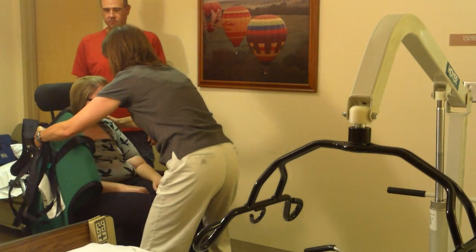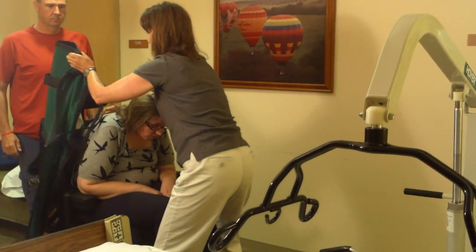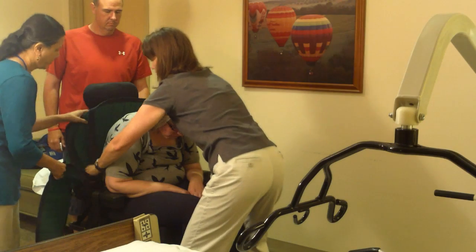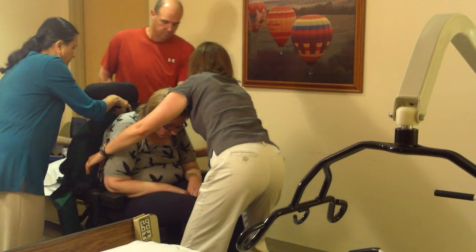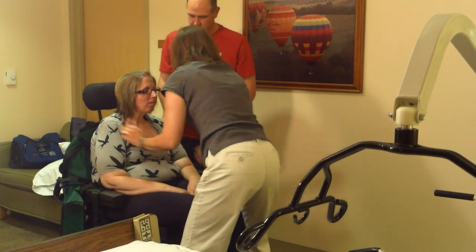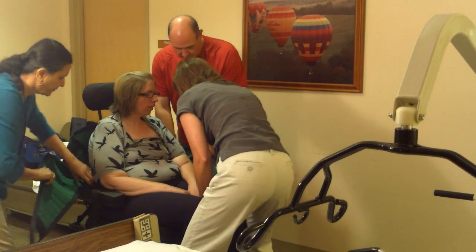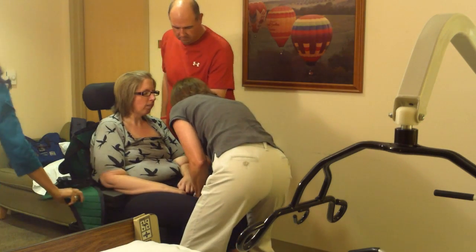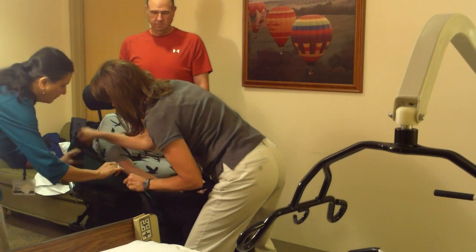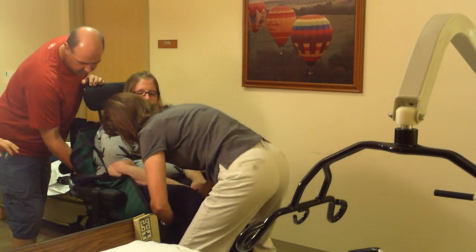You will support the patient from the front and lean them forward so that you can put the back of the sling in between the patient and the chair. Try to make sure that it's all the way down. The leg pieces will go under each leg individually and cross in the middle through the loops.